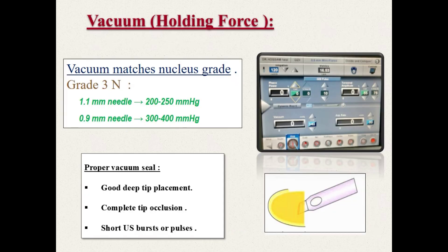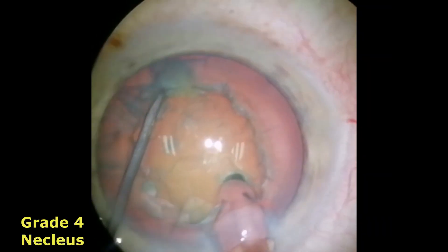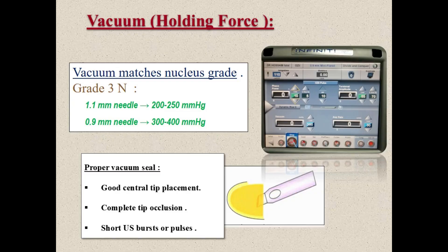The most important point in faco machine settings is to adjust the vacuum level to match the nucleus hardness. Hard nuclei require higher vacuum levels to withstand the great compression force needed to fracture these dense nuclei. On the other hand, a soft cataract may need zero vacuum. To optimize the holding force of vacuum, ensure a deep facotip placement to reach the firm endonucleus. Retract the sleeve of the faco needle to expose more metal and bury the facotip completely into the endonucleus. The role of ultrasound is just to impale the faco needle into the endonucleus, so press the foot pedal to position 3 for a very short pulse and rapidly return to position 2.